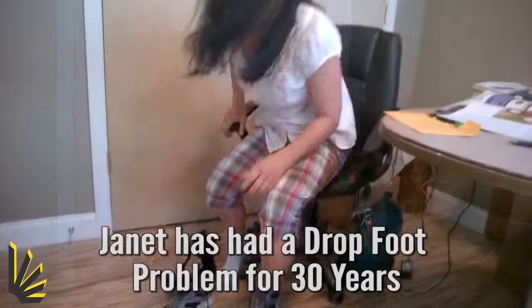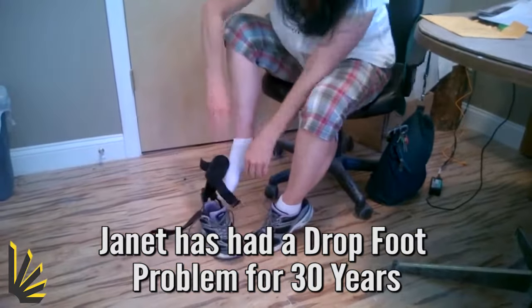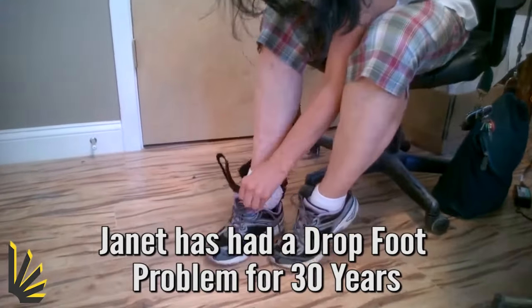My name is Janet Ledger, and I have had a drop foot problem for 30 years. This is my drop foot — I don't have the flexion in it. I'll put the brace on, which is really easy and comfortable to use.